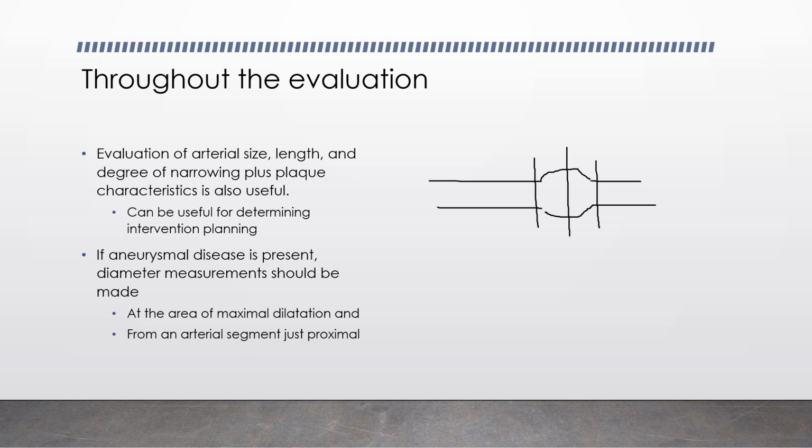And we're going to take measurements of the width of it in each of those three locations. So you do transverse proximal with and without measurements, transverse mid with and without measurements, transverse distal with and without measurements. You also want to, in long, in this image here, measure the length of it. Okay, then you'd go in and you'd add color.